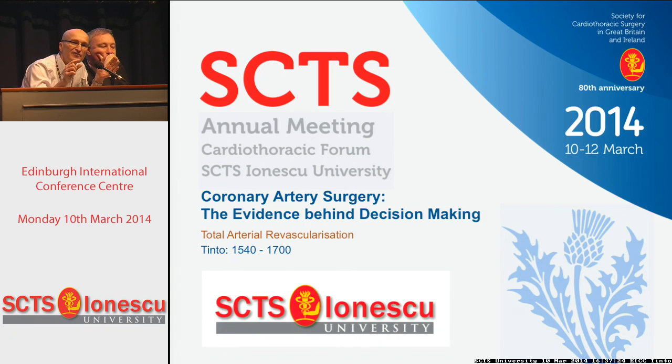So the advantage of FFR is that it's giving you a better true indication of the functional severity of the stenosis than you get by eyeballing it. If we see a stenosis over 90%, we don't need FFR. But those intermediate, hazy, slightly narrowed lesions, as FAME showed, when you try to eyeball these, you may as well toss a coin, because what we're often doing is making a guess. And if you're going to do 3 left-sided vessels, then the best chance of survival of your arteries is to place mammary arteries and radial arteries to the vessels with the most significant stenosis. And that's where FFR can be advantageous.